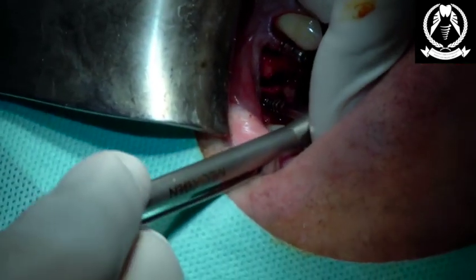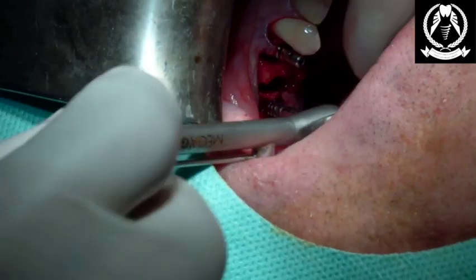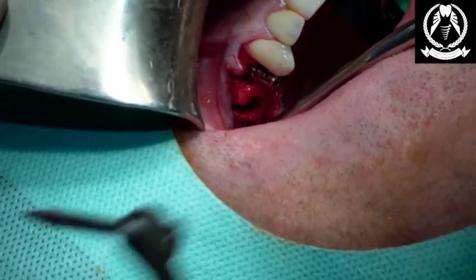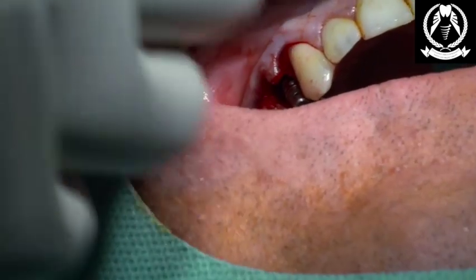Mate, have you seen this? Look, it's solid. Scottish bone. It's beautiful. Right. So I'm quite happy with that. It's just crestal placement over there. Quite happy with the prosthetic position for a bridge. Open for me, Alan. And we're going to get me some Ethos, please.